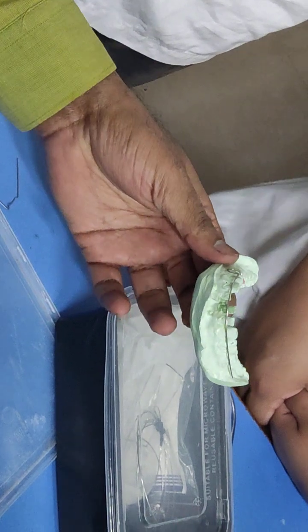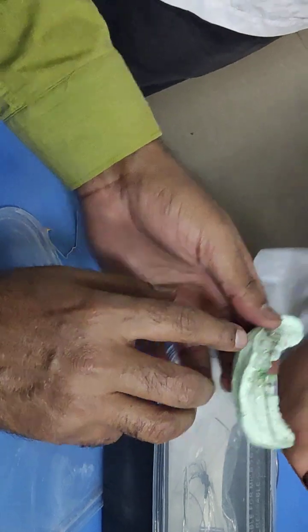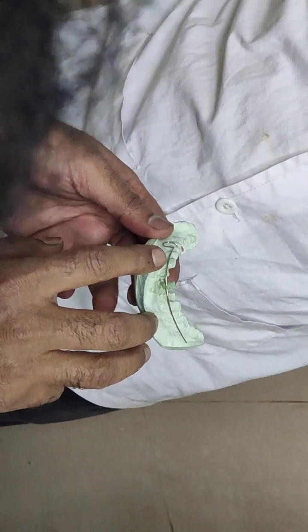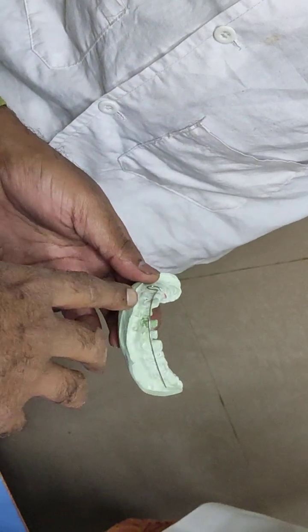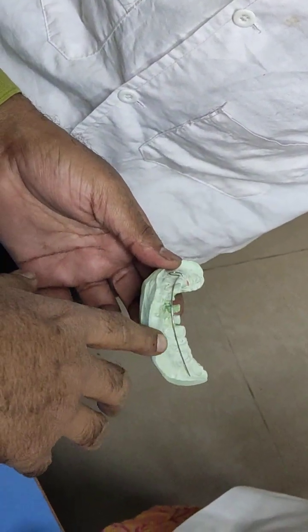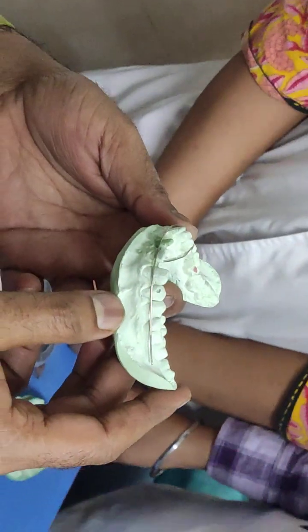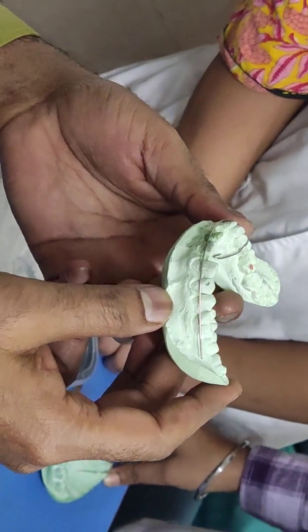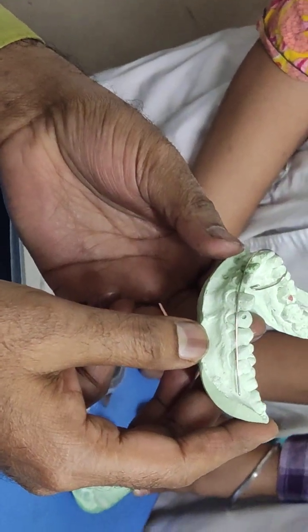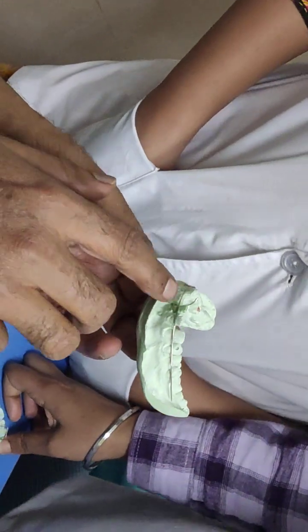Now remember, here lies the importance of leveling the wire. Now it is showing that the wire is to some extent going a little bit downwards, not exactly the same level. No, actually this illusion is because the wire is on the same plane.